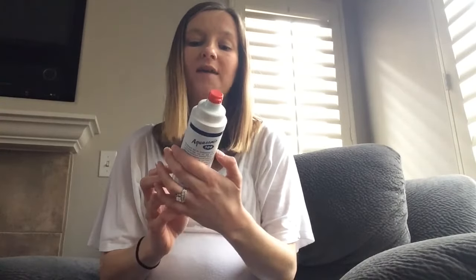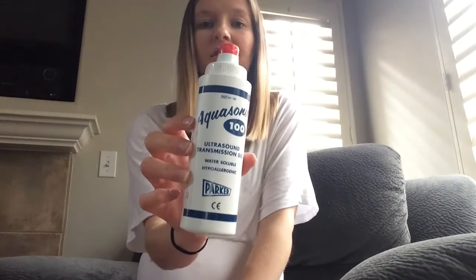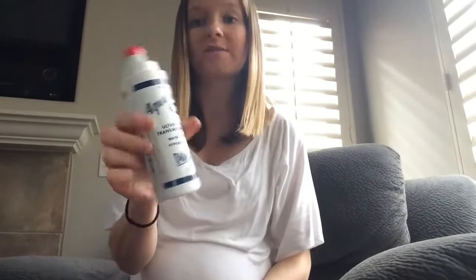To use the fetal Doppler you have to have some kind of conductive fluid. A lot of product reviews recommend buying an ultrasound transmission gel, so I bought this off Amazon — it was like five dollars, not very expensive. I've also read reviews of people saying you could use coconut oil or aloe vera gel, as long as it's not too tinted — apparently the green ones don't work as well. I haven't tried any of those personally; I just use this ultrasound gel. It was easy and not very expensive.